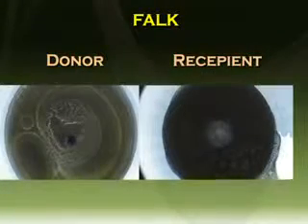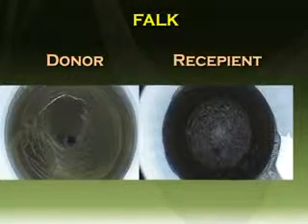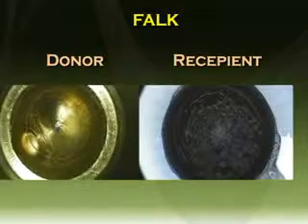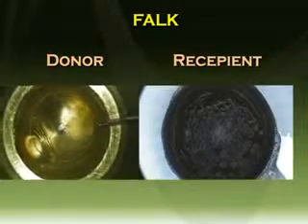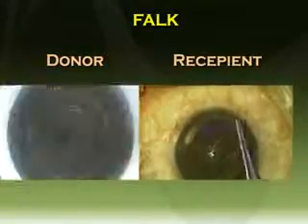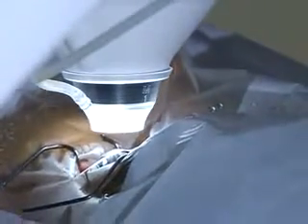Femtosecond assisted ALK can provide extremely precise cuts and smooth interface in clear corneas. But in pathological corneas, the scar tissue poses challenges for laser penetration and has a different refractive index as compared with the transparent corneal stroma. Compression by a flat applanating interface cone may lead to reproduction of irregular corneal surface at the interface.